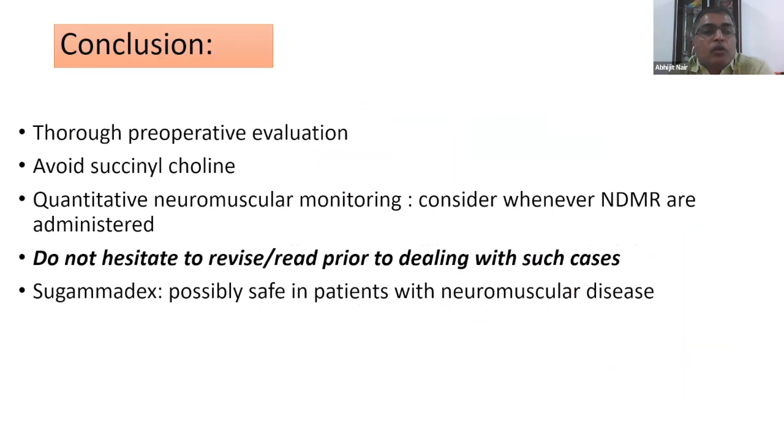So to conclude, a thorough preoperative evaluation is necessary. Avoid suxamethonium as far as possible. Quantitative neuromuscular monitoring is a must. Do not hesitate to revise or read up prior to dealing with such cases.